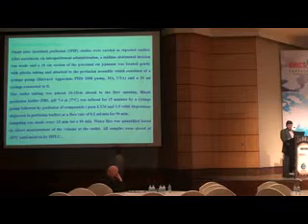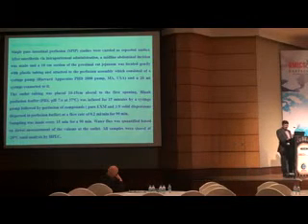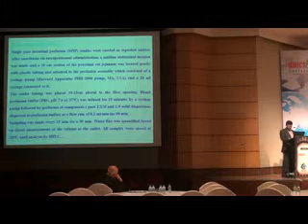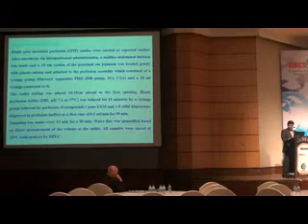And further, to understand the improvement of permeability, in situ permeability studies were conducted by single pass intestinal perfusion, which has been done as per earlier reported methods. After anesthesia by intraperitoneal administration, a midline abdominal incision was made, and a 10 cm section of the proximal right jejunum was located and gently attached with plastic tubing to the perfusion assembly, which consisted of a syringe pump, with a 20 ml syringe connected to it.